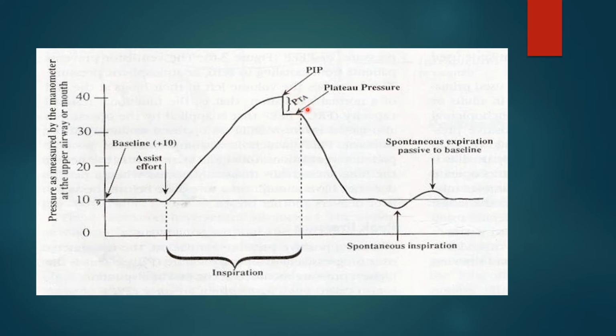You're going to learn about these trans pressures, but this is the trans airway pressure. This is the pressure difference across the airways. So one end of the airway is at the proximal end of the ET tube, and this pressure, remember, is the alveolar pressure. So we're seeing the difference between these two pressures, so we know what that pressure gradient is, and that pressure gradient is called the trans airway pressure.